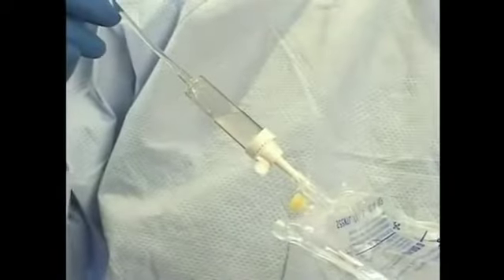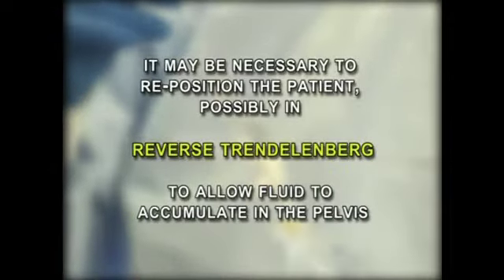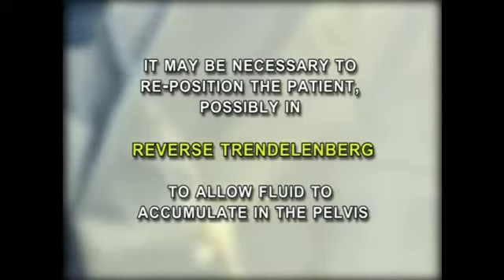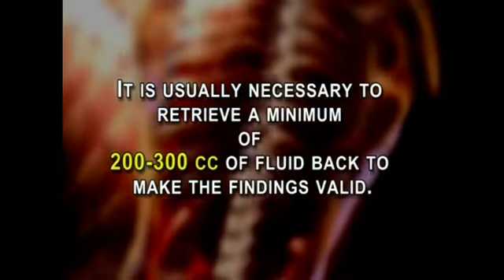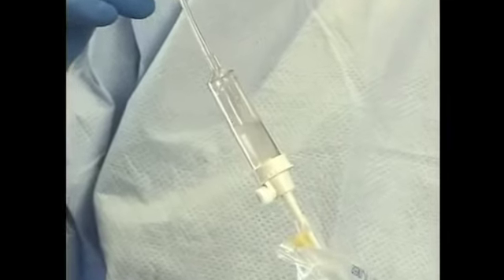As much fluid as possible is allowed to drain out under gravity, and it may be necessary to reposition the patient, possibly in reverse Trendelenburg, to allow fluid to accumulate in the pelvis. It is usually necessary to retrieve a minimum of 200 to 300 cc's of fluid back to make the findings valid. A sample of this aspirate is then sent for analysis.